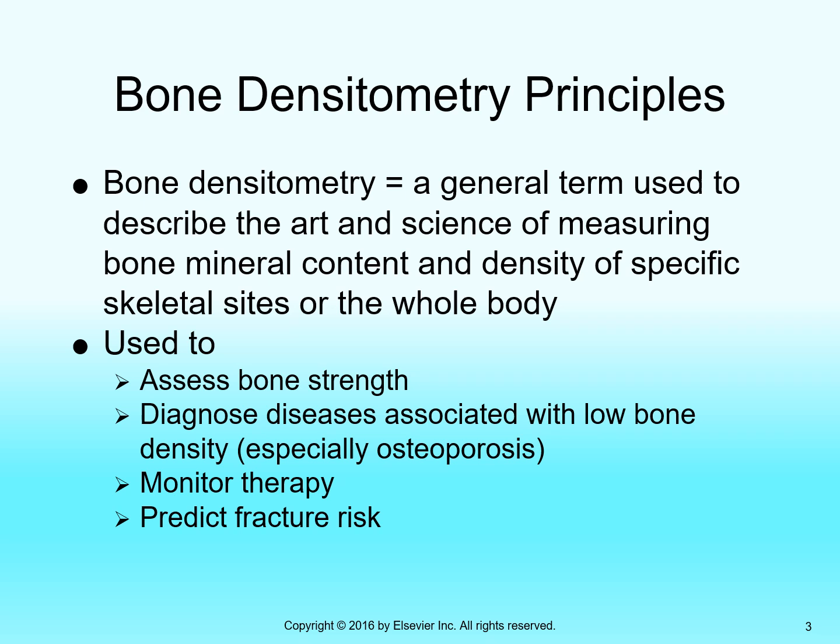But that ratio is consistent for consistent part thicknesses and tissue densities. So we can isolate the presence and density of calcium in the bone tissue by using a high energy and a low energy beam, and then looking at the difference in attenuation between them.